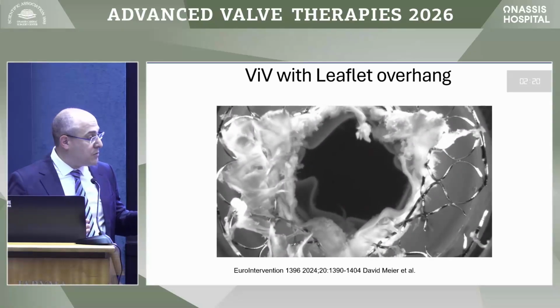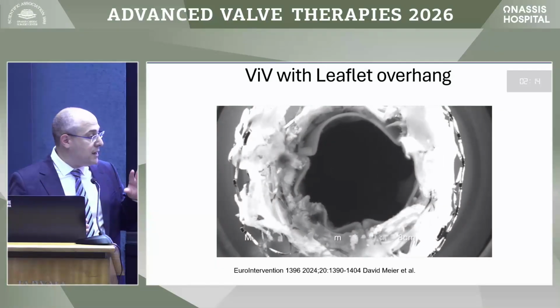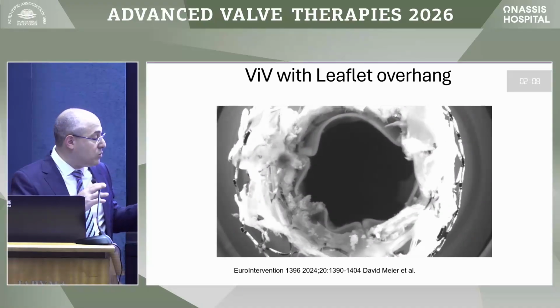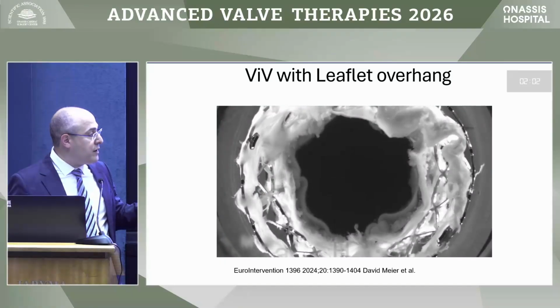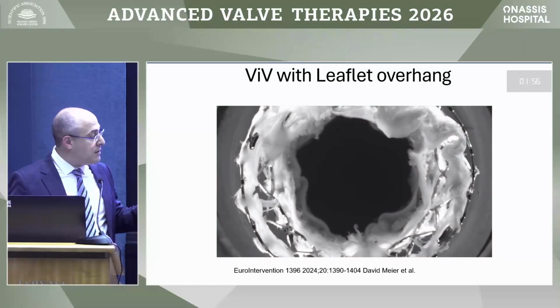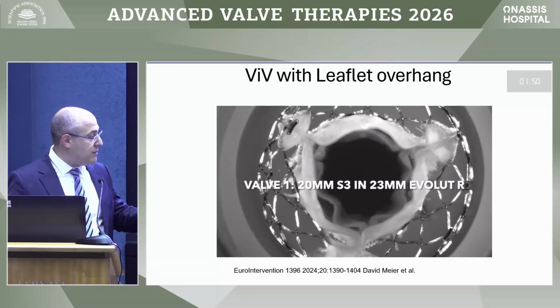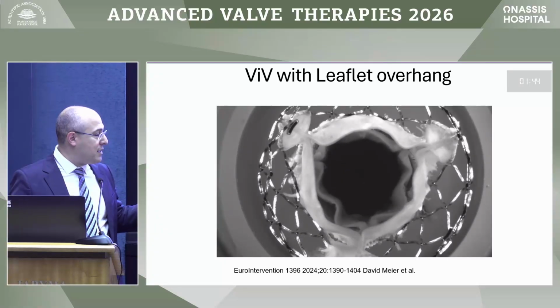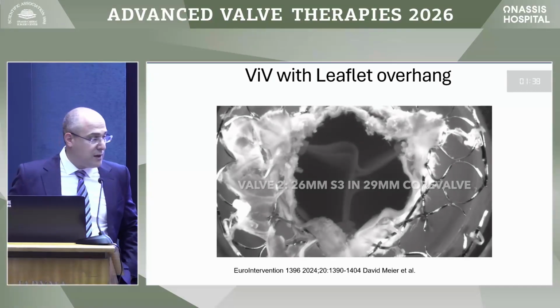By the way, we come to understand that there is a new complication of low implantation of TAV in TAV, which is LV embolization. There is a cluster of cases, it's sad, and we have no good solutions. Imagine you have a failed Evolut, you're afraid of having coronary obstruction, then you say, okay, I'll put it low. You implant it, 10 seconds later you find that Sapien dancing in the LV. And to be honest, we don't have good solutions for that in the cath lab. And sending patients like that to the OR means in many times death. So this is a life-threatening complication as well.